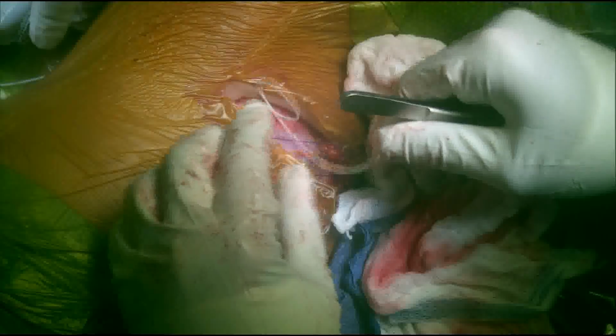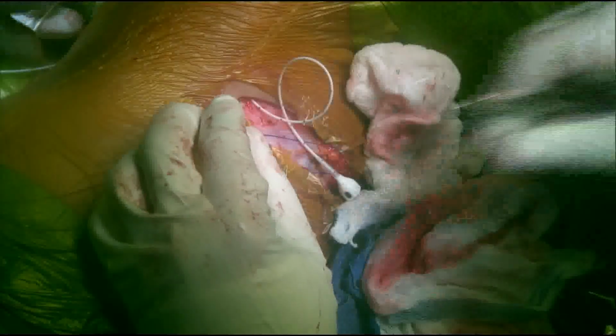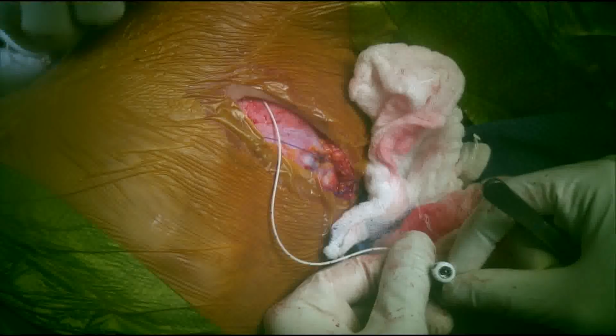Usually a 360-degree loop is kept at either end of the catheter, both at the abdominal side and the spinal side, in order to ensure there is enough length for connection to the baclofen pump and also for when the patient grows up. Once you are happy with the length, you can cut any excess length from either the pump segment catheter or the spinal segment catheter.